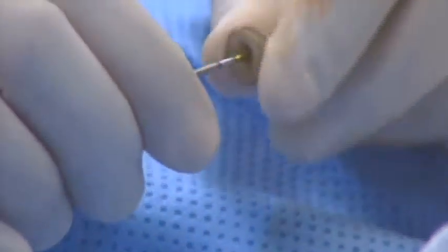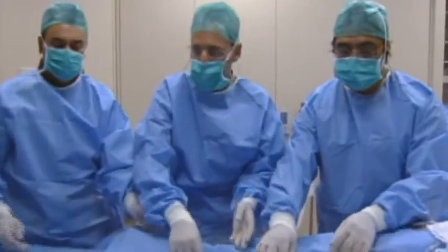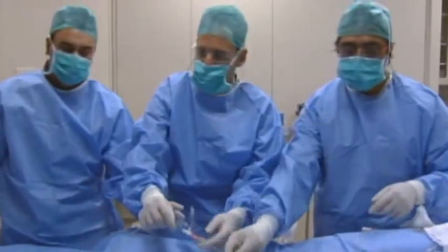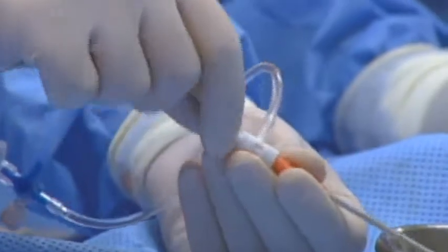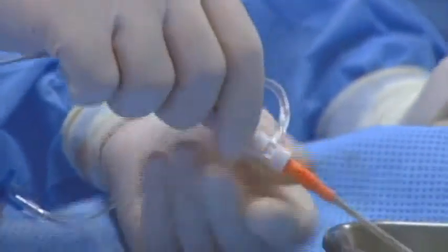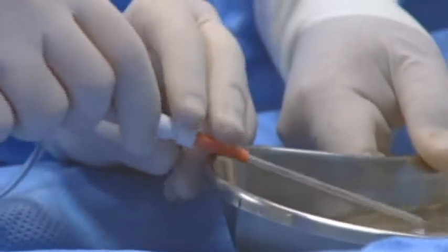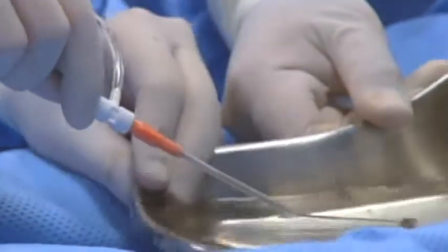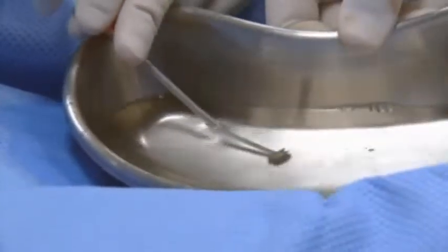So now it's been screwed, right? We're going to do that underwater. Can you show here my hand? Does the windsock influence your choice of devices? Sorry, when I said here type 2, it's type 1. The discs are exactly the same. This is the correct device. So we are on the same page. We agree, right? A little bit of difference on the size.